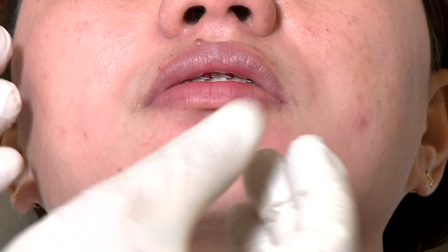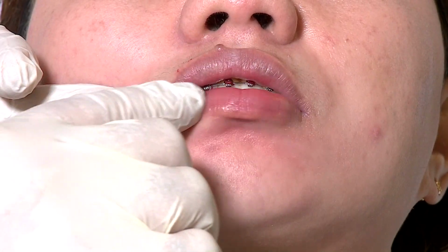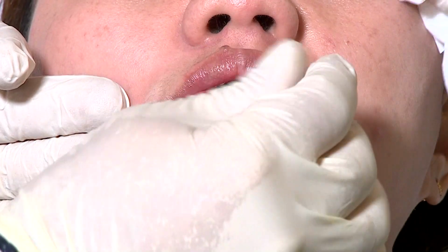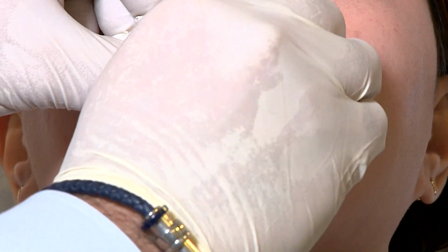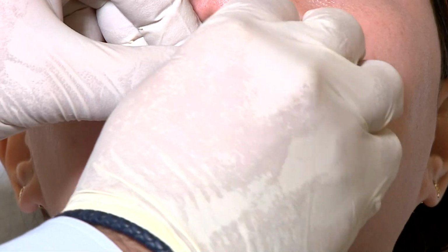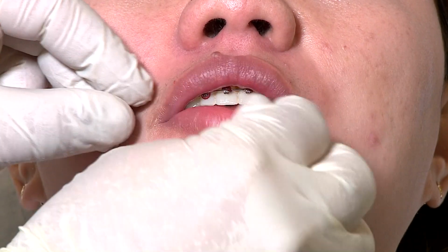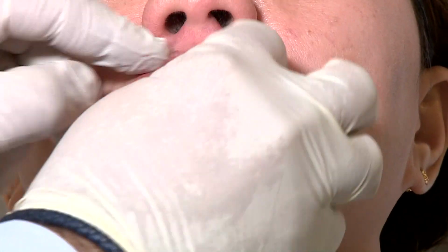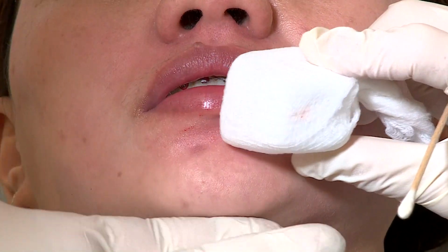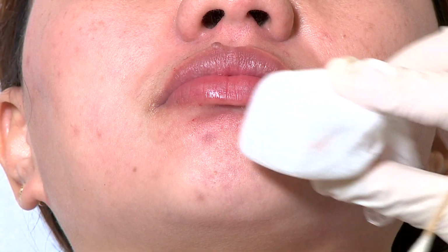As we can see, avoiding inserting the sharp needle directly from the mucosa has the advantage of giving us less bleeding, less bruising and less swelling. You do gentle massaging just to make sure that the product has blended in with the skin, and you can advise the patient to do a little bit of massaging at home as well. Always reassess after you finish injecting to double check there is no asymmetry. Close your lips. She might need a little bit here, and that's it.